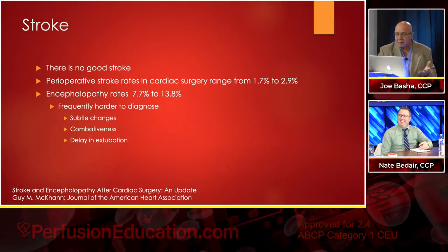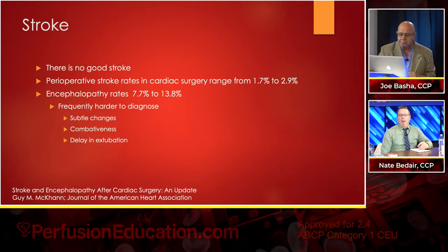Yeah, I'm asking. I would think it'd be flow related mostly because of the manipulations we're doing with the heart. Most of our surgeons, all of our surgeons, come down on flow, and if I'm mistaken, all of them want you to come off at that point. Maybe one or two will just want you to come down to minimal flow, a liter or whatever. For what? To put the cross clamp on. Oh yeah, but that's transient. Well, no, that's very transient.